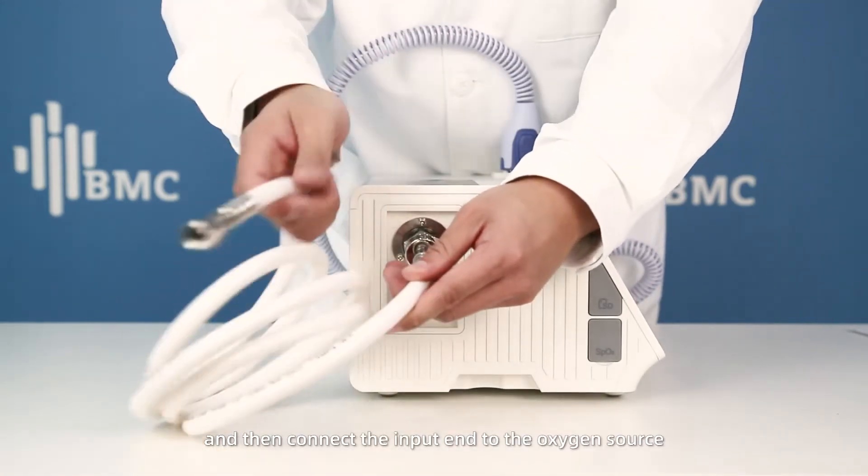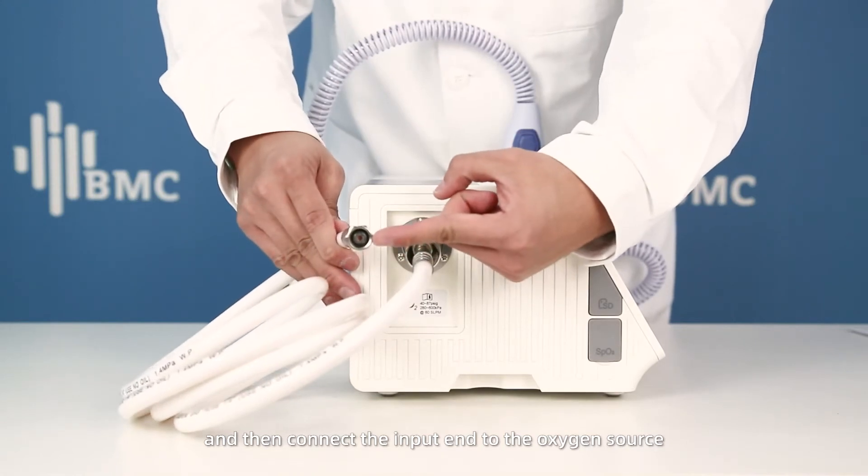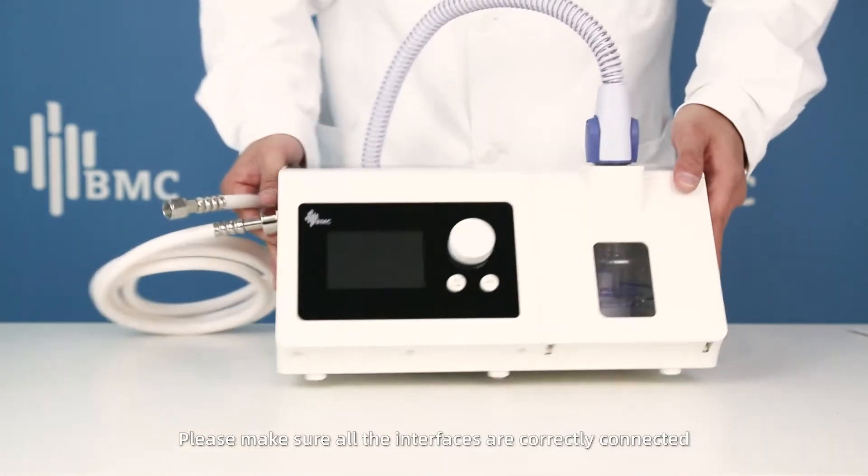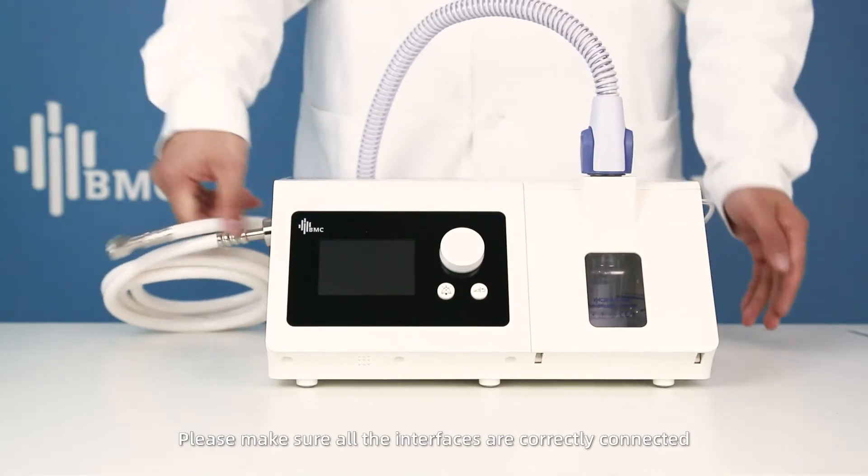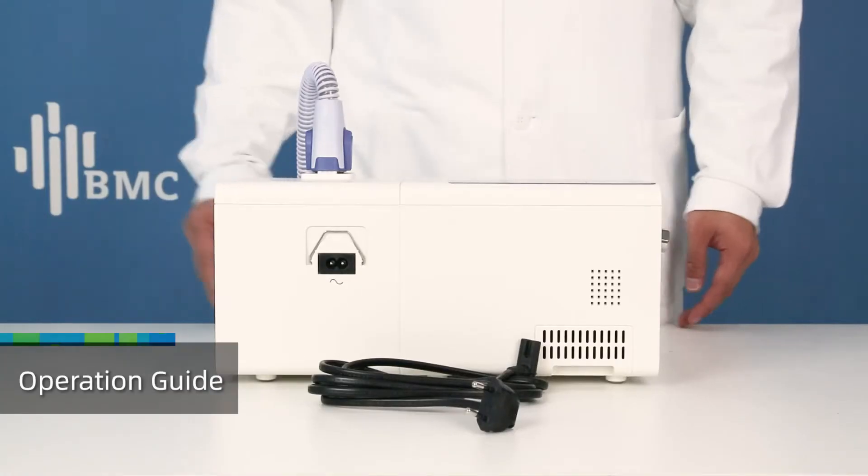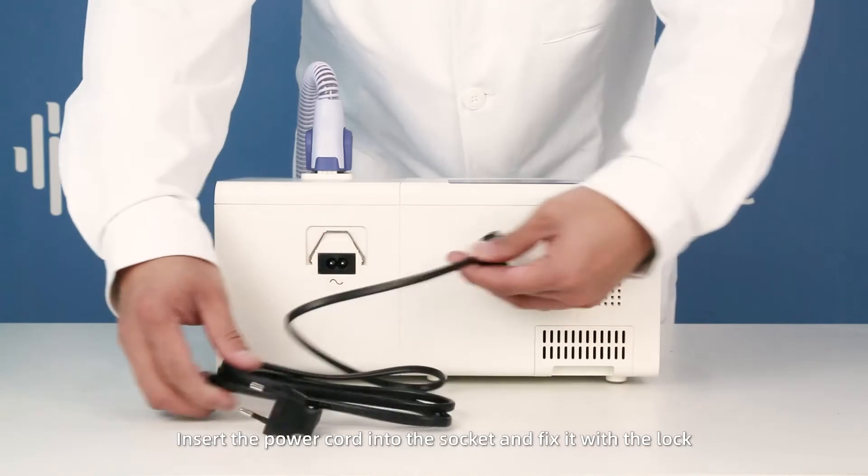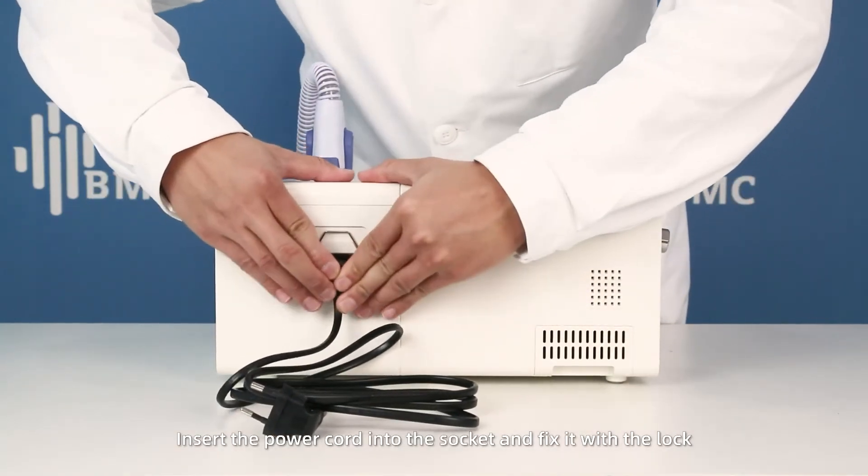Then connect the input end to the oxygen source. Make sure all the interfaces are correctly connected. Operation guide: Insert the power cord into the socket and fix it with the lock.